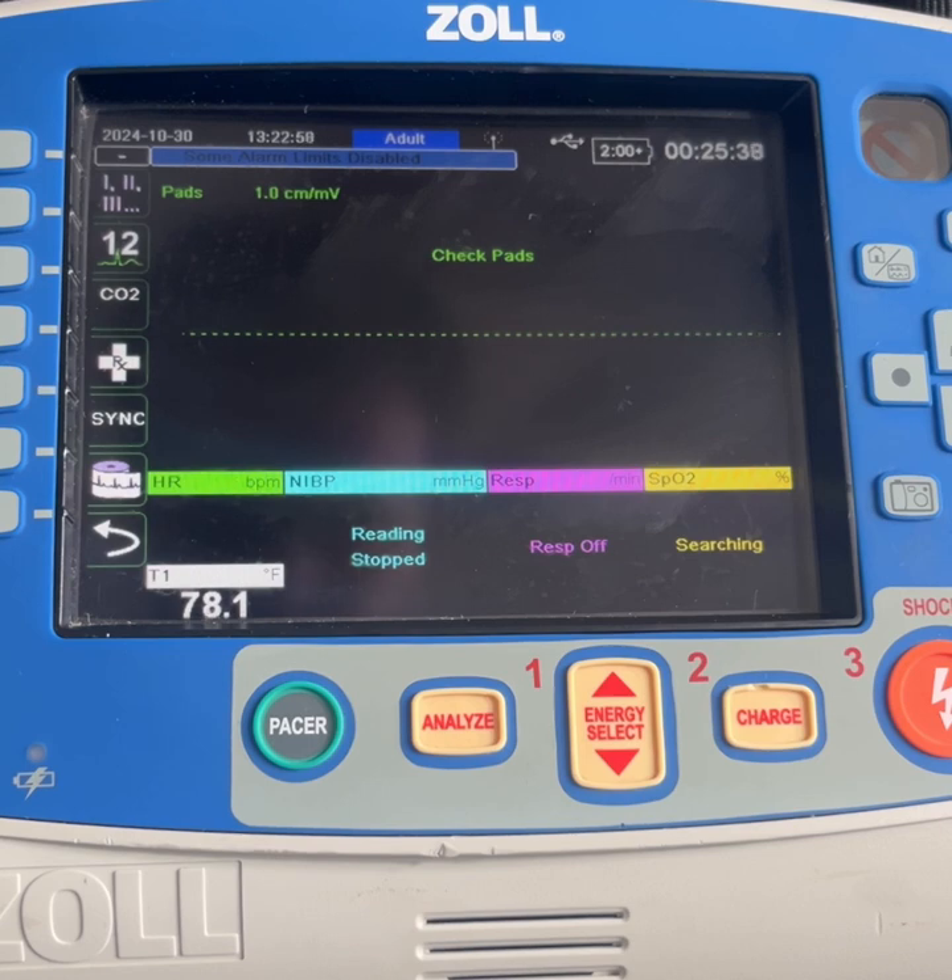And what you're deactivating is a technology called impedance pneumography, which gives you a respiratory rate based off the rise and fall of the patient's chest cavity if the limb leads, in particular, are placed on the patient's torso.